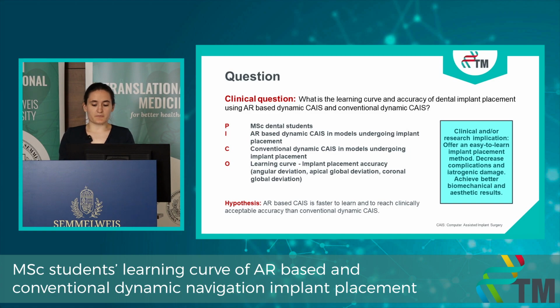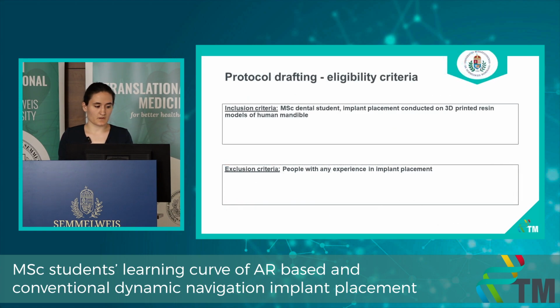And we would like to offer an easy-to-learn implant placement method, decrease all complications and iatrogenic damage, and have better biomechanical results. So we would like to include MSc dental students who are inexperienced in implant placement, and we would like to place implants into 3D printed resin mandibles.